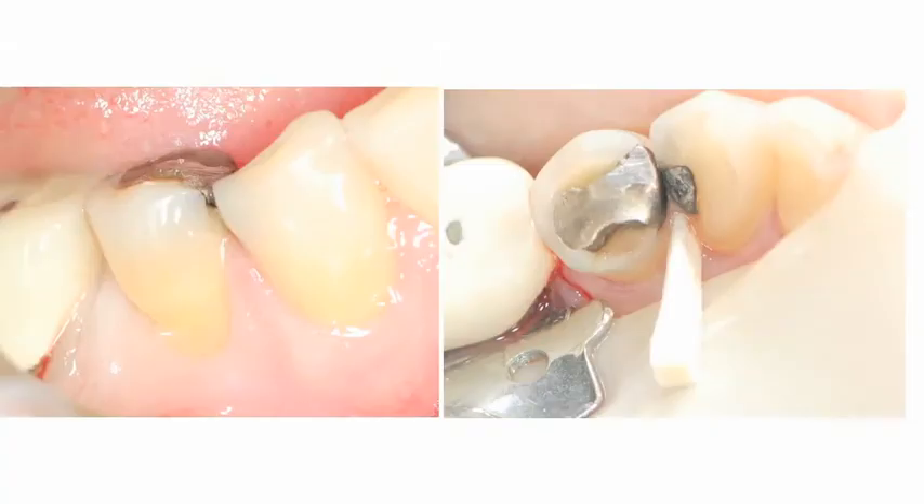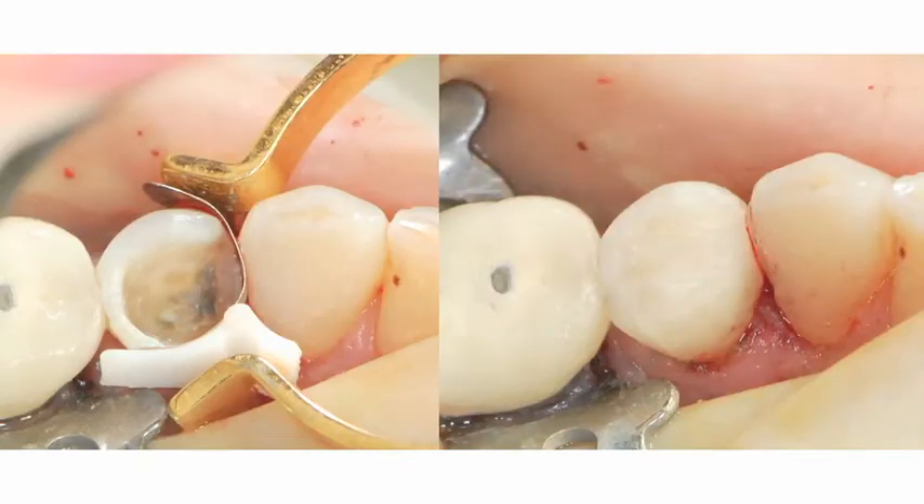Here is another challenging case. This older patient fractured tooth number 21, the lower left first bicuspid. This tooth has significant buccal recession and a small, thin mesial contact area. All the separating rings will ride up the cingulum area of the left bicuspid. An extra small left ABC Wedge was placed between the teeth, creating a parallel wall, allowing placement of the separating ring.